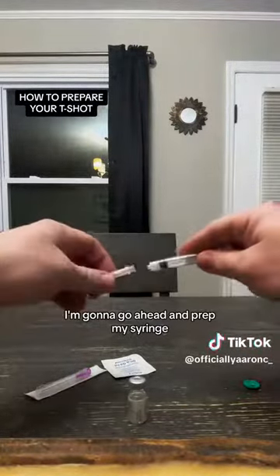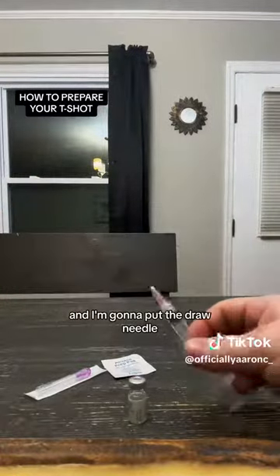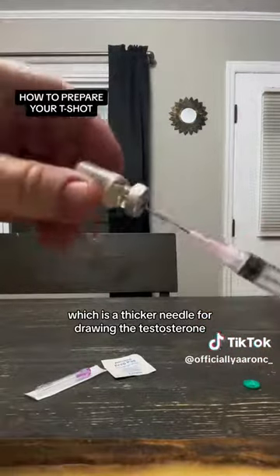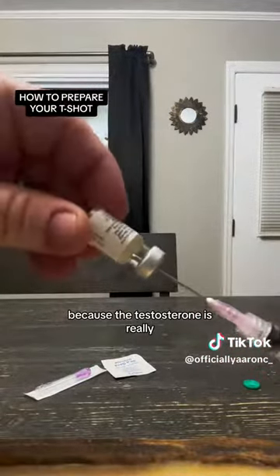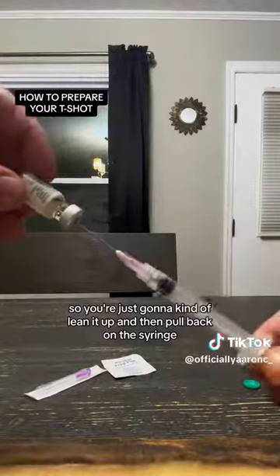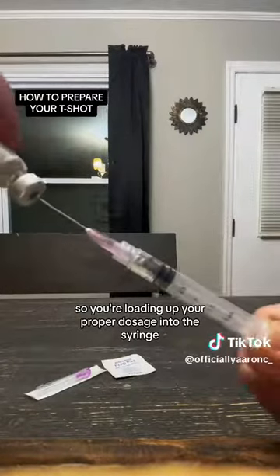First things first, I'm going to go ahead and prep my syringe. I'm going to open that package and then put the draw needle, which is a thicker needle for drawing the testosterone because the testosterone is really thick. You're just going to lean it up and pull back on the syringe, loading up your proper dosage.